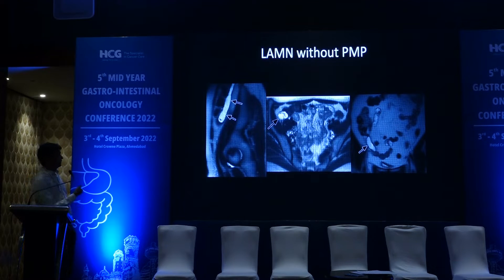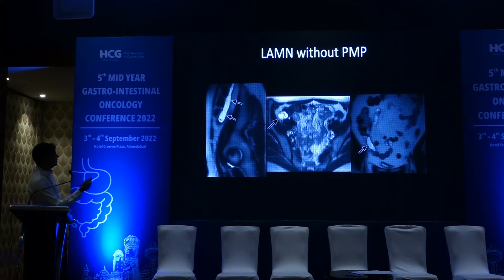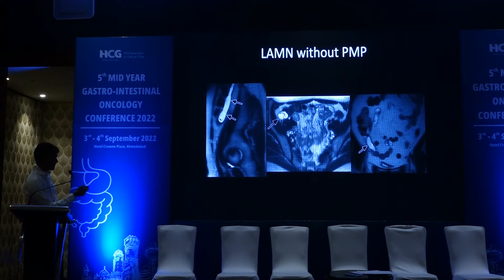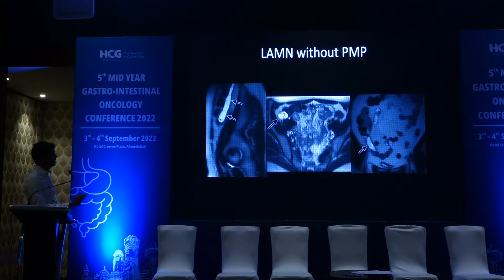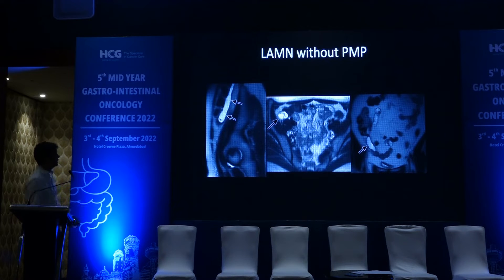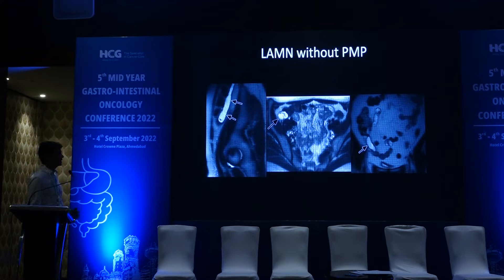These are the MR images — sagittal, axial, and coronal. There is a linear tubular structure with internal septations at the base and no peri-appendiceal lesion seen. You are not able to see any peri-appendiceal fat stranding or any fluid collection except a thin anterior fluid strip. So this is a low-grade appendiceal mucinous neoplasm.